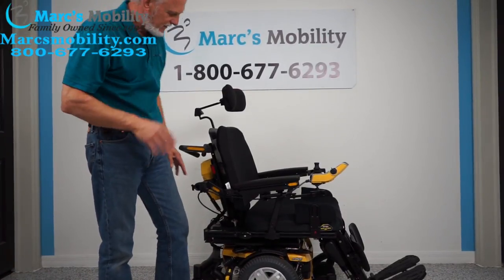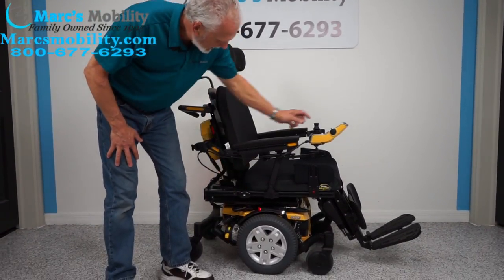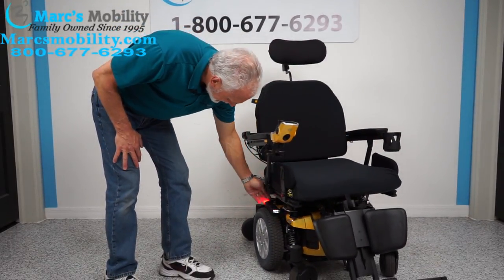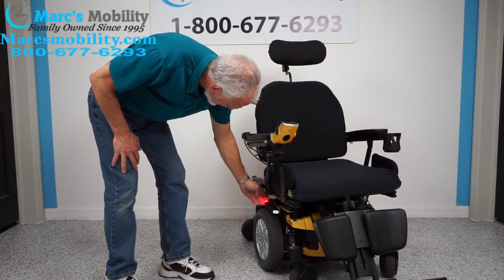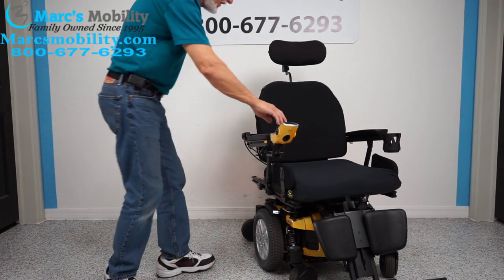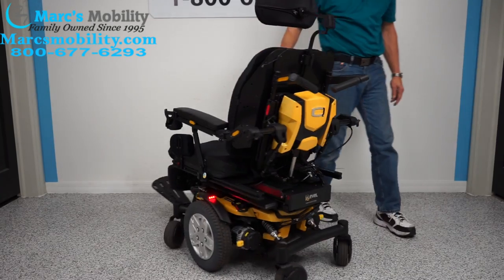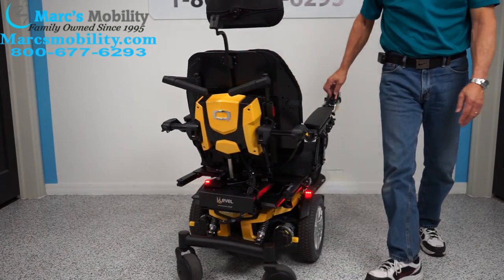The chair is also equipped with lights. There's a little button right here — if I hit it, you can see the light on the front and you can see the back tail lights. There are tail lights and headlights. If I go around a circle you'll see the tail lights and the headlights.